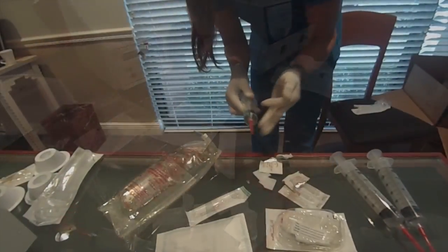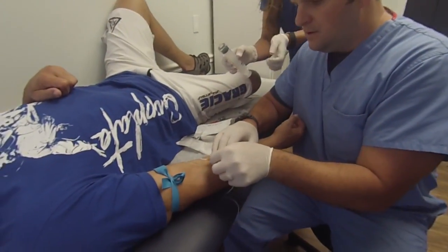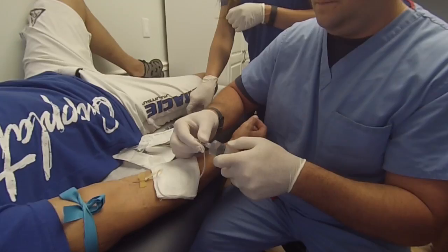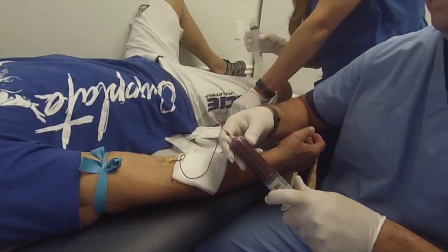Take these syringes along with the other components for blood collection to patient bedside. Prepare the patient for blood draw and perform venipuncture using the provided butterfly needle. Connect the syringe to the extension line of the butterfly and begin blood collection, collecting blood into the syringe to reach a total volume of 45 mLs.